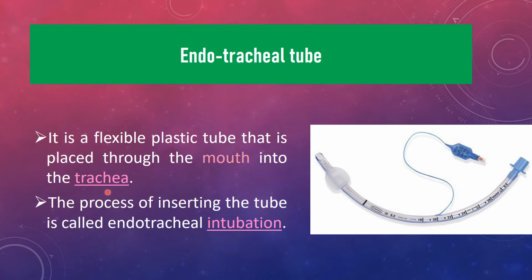And the process of inserting the tube is called endotracheal intubation. Inserting the tube is the procedure known as endotracheal intubation.